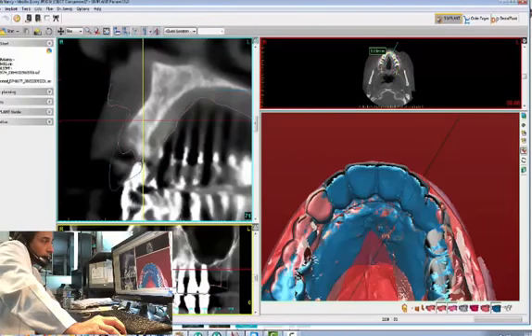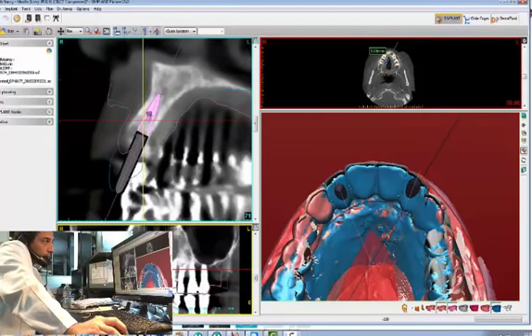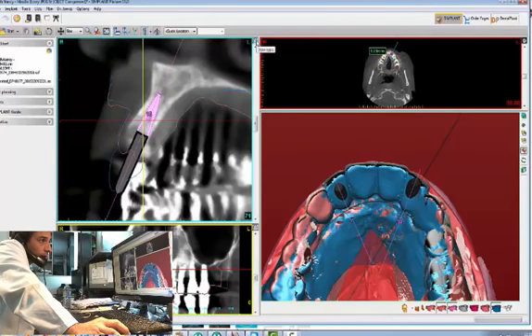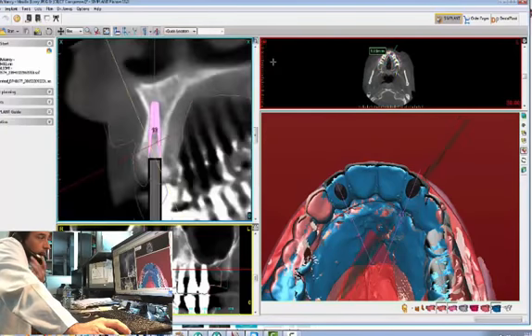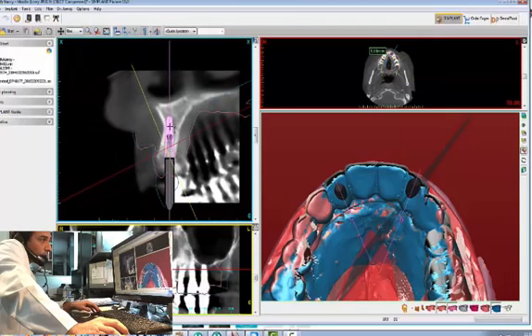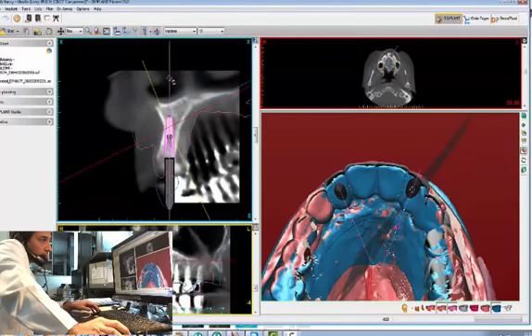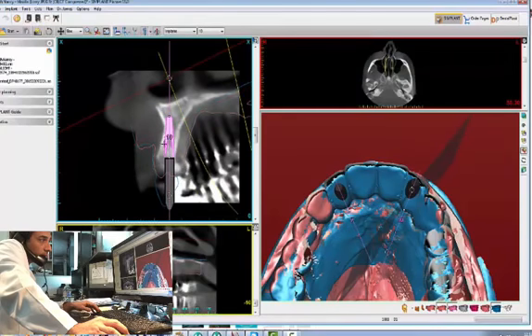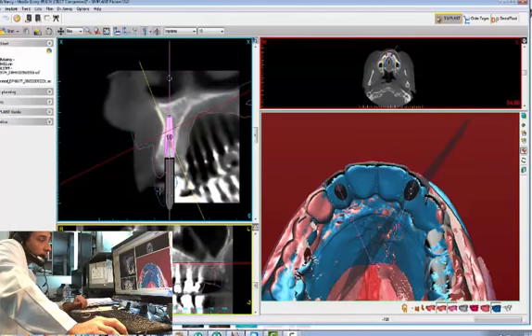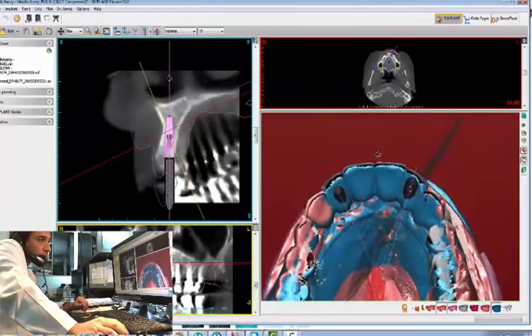You can see the outline of the tooth. I already positioned an implant in there that is almost coming through the cingulum. I did the same for number seven and ten. I just put it in there — I just didn't do any fine-tuning yet. I can probably get it a little bit more closer to the cingulum by rotating the implant a little bit to the palatal. But you see there's a concavity on the buccal, so there's a limit of how much we can do that. I can move the implant a little bit bodily to the palate. From a restorative position, you're in pretty good shape there.